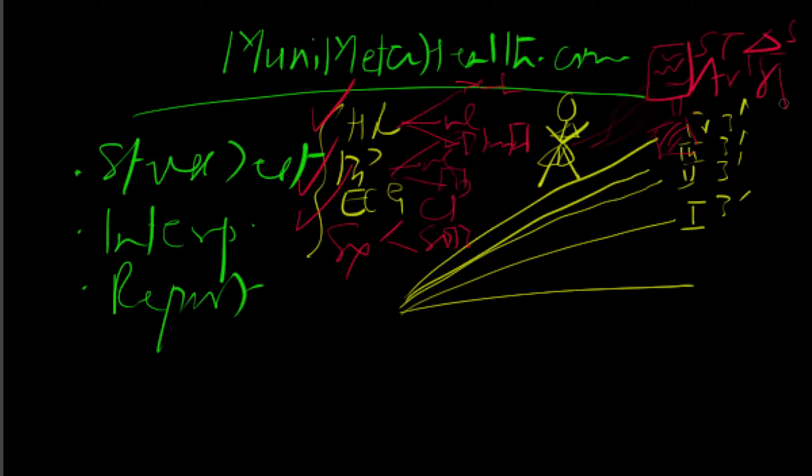And what are the commonest arrhythmias? You'll see a lot of APCs. You may see a lot of VPCs. If they're isolated APCs and VPCs, you can live with it and continue with the stress test. It's not a big deal. But if they're occurring in bigeminy, trigeminy, couplets, those VPCs could be another reason why the test could be stopped. Okay, rather let's use the word stopped. So these are some of the reasons why the test could be limited based on what we see on the ECG, the heart rate, the blood pressure, and the symptoms.